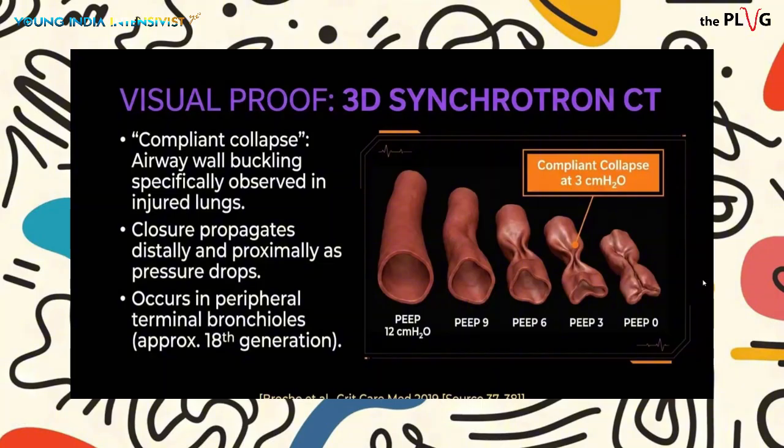So this phenomenon is very important to understand, because the airways are closed. How is the air going to go in? If you are setting a PEEP below what is required to open up the airways, the air is not going to go in. That is the fundamental concept.